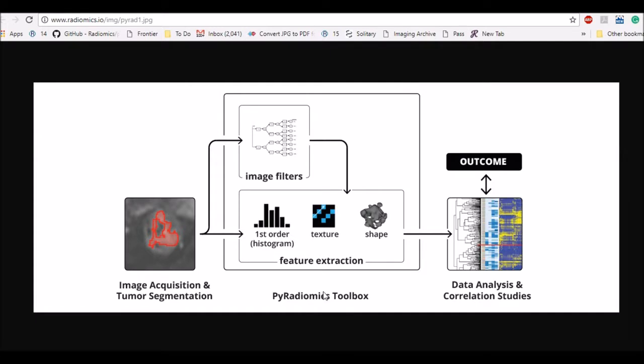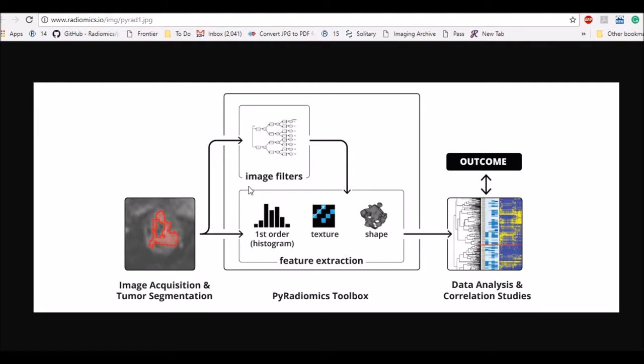PyRadiomics is a Python based toolbox which offers image filtering and feature extraction capabilities. An input image such as a 2D or 3D image of brain or lung can be fed into PyRadiomics toolbox, and the toolbox can be used for applying image filters to the input image or it can be directly used for extracting features for further data analysis and drawing conclusions.